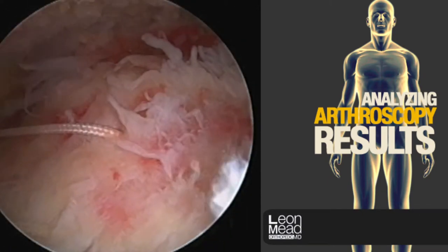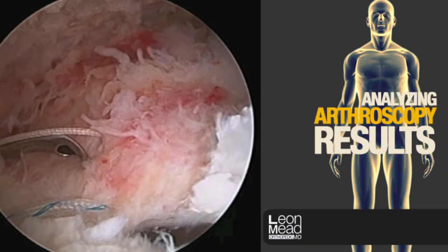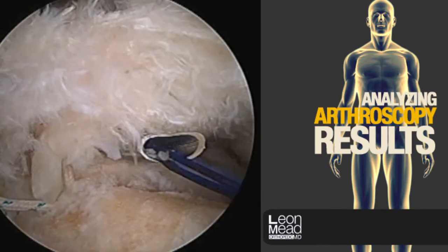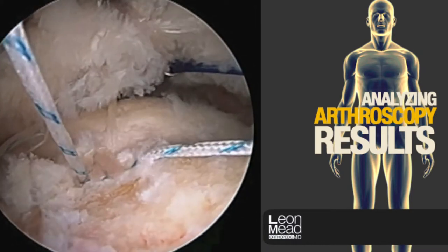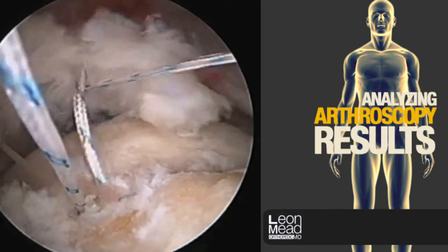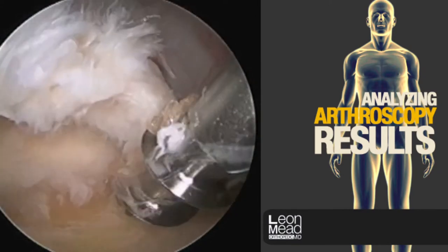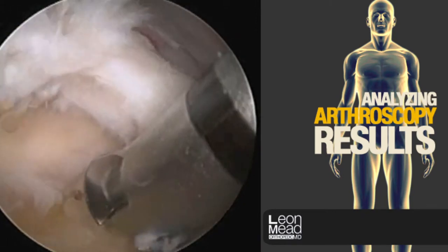We've passed two sutures. Using a similar technique shown earlier, the suture passer goes through the cuff itself. A shuttle stitch is coupled with one limb of the suture at a time, then retrieved through the cuff. Where we see all four limbs passed, we're going to place a second anchor next to the articular margin adjacent to where the biceps tendon would normally run.